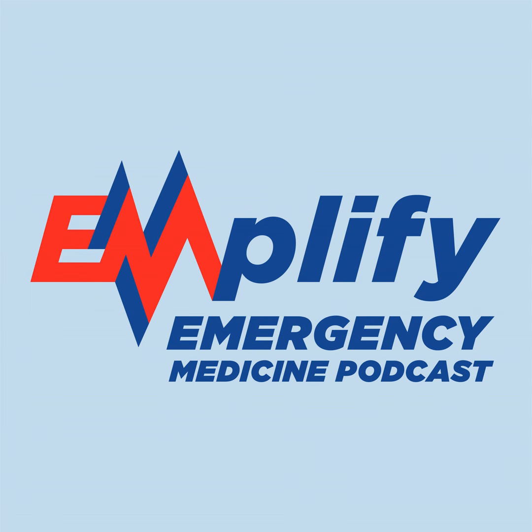But in a pressure supported mode, you don't know what tidal volume they're going to get off the bat. It depends on their lung mechanics and it depends on the patient's effort. And so you're not guaranteed, although there are backup tidal volume minimums you can set. The amount of tidal volume they're going to get is going to be dynamic based on those things. And for me, because in the ED things are changing so rapidly, paralysis is wearing off or patients' conditions are changing, I prefer to have the guaranteed minute ventilation, the guaranteed tidal volumes that are associated with volume assist control mode types of ventilation. In our ED, we happen to use PRVC.